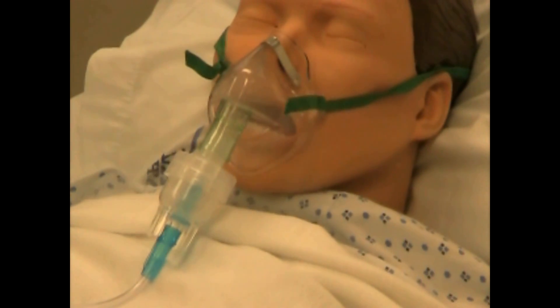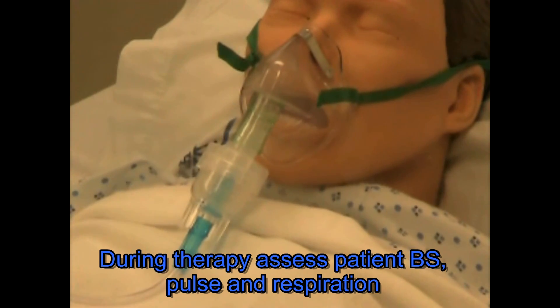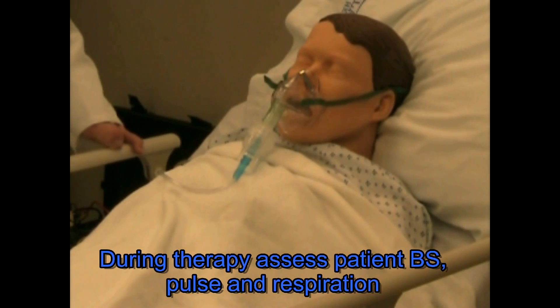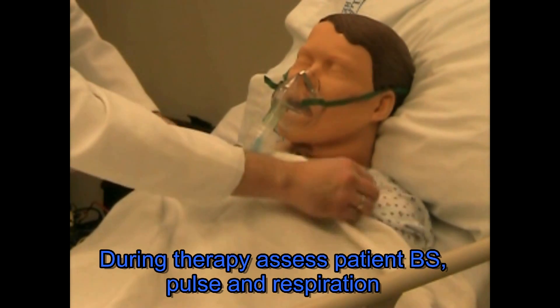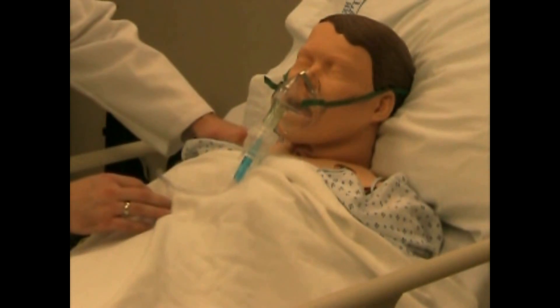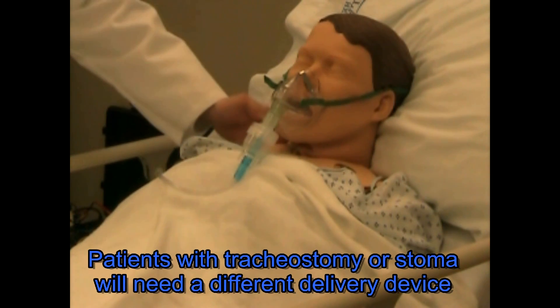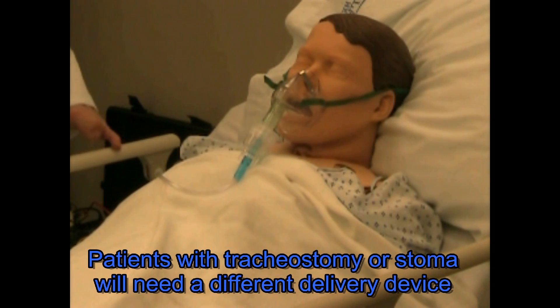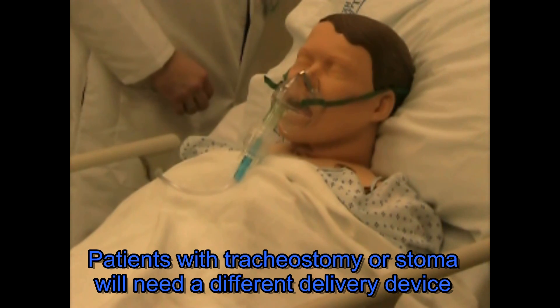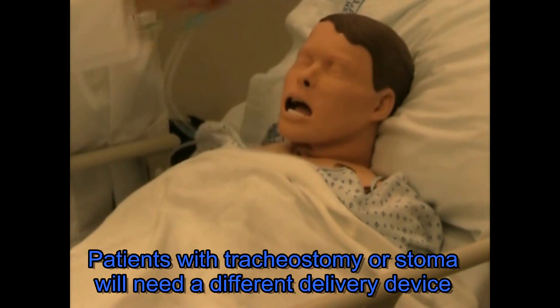I'm just going to stay here at your bedside and monitor during your treatment. Do check the patient and make sure that the medication is being delivered well. In some patients that have either a trach or stoma, you'll need to deliver the aerosol to that area instead of the mouth and nose.